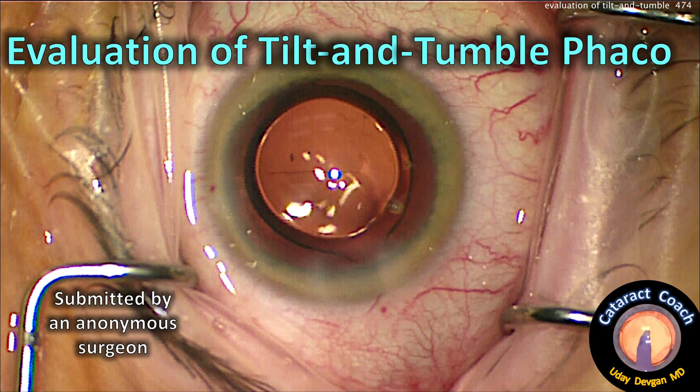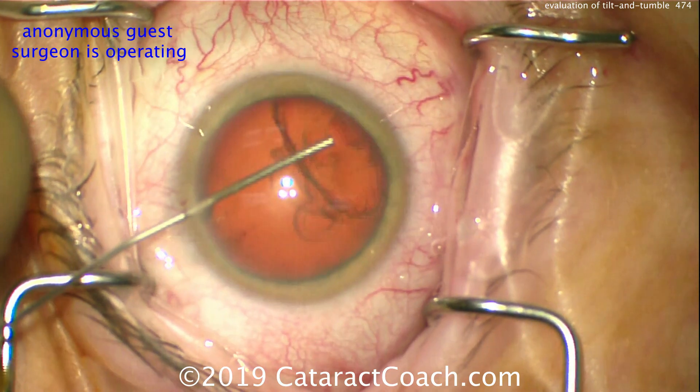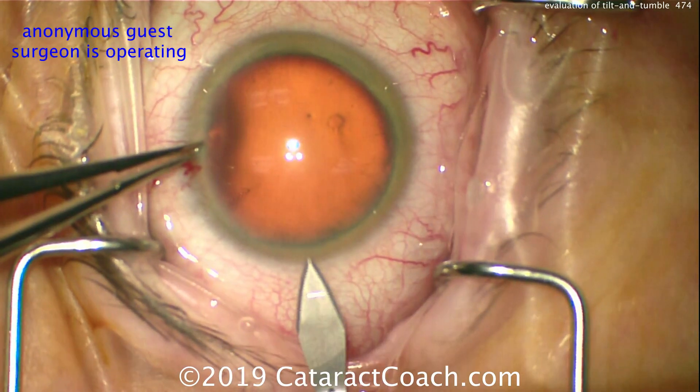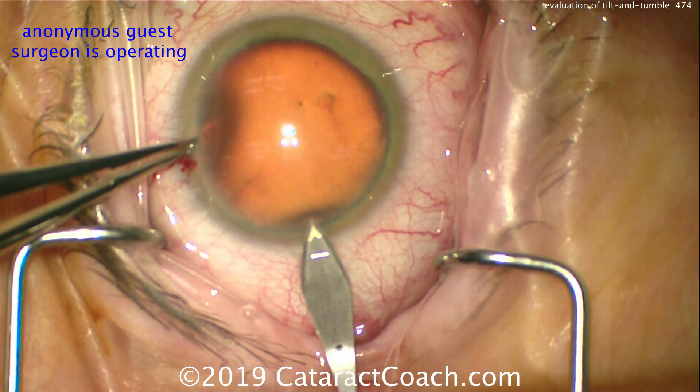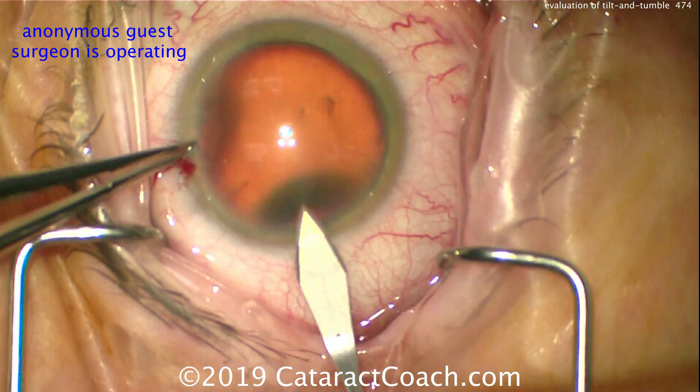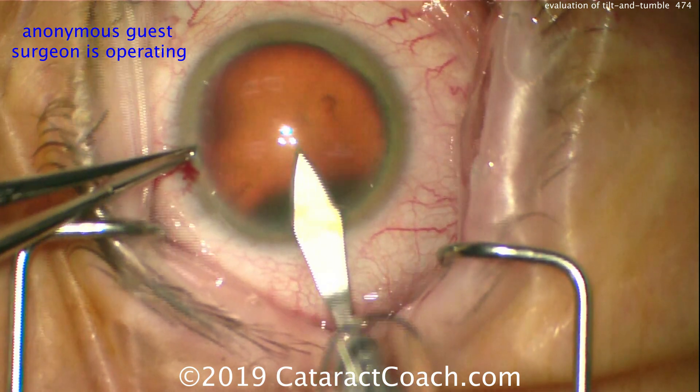Evaluation of a tilt and tumble FACO, submitted by an anonymous surgeon. So let's watch the case here. There's a good fill of the anterior chamber with viscoelastic. Here comes the main incision — that looks pretty good. Nice tunnel length entering the anterior chamber now. I like the incision. Looks good.